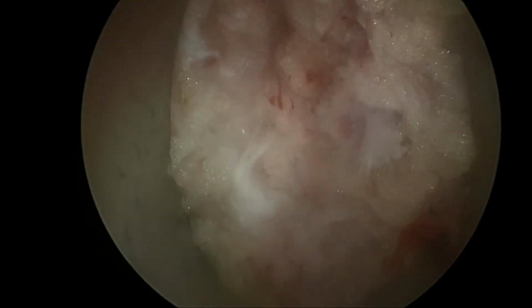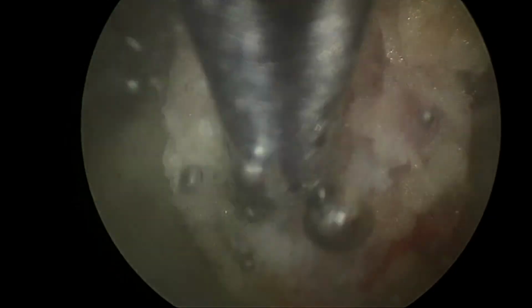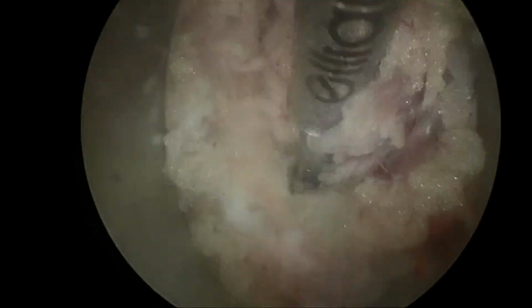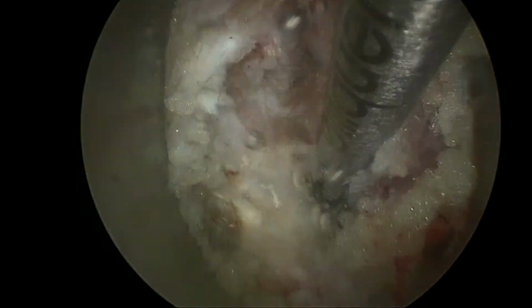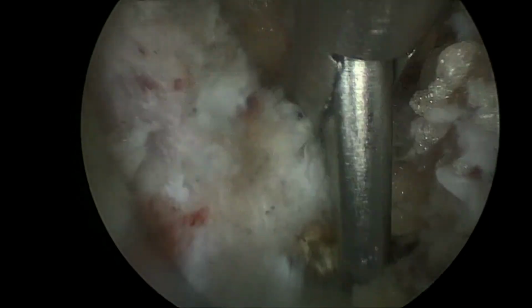Once the endoscope is introduced, remember we're on the left side. So 12 o'clock is medial, 6 o'clock is lateral, on the right is caudal, and on the left is rostral. Soft tissue is resected and coagulated in order to expose the underlying bony anatomy. Here we see the L5 lamina coming into view. I will then proceed to further define the inferior or distal aspect of the L5 descending facet process down to the joint.